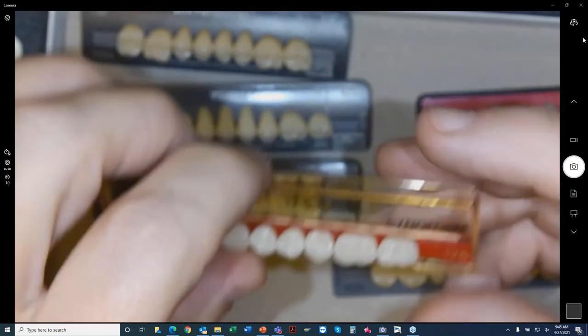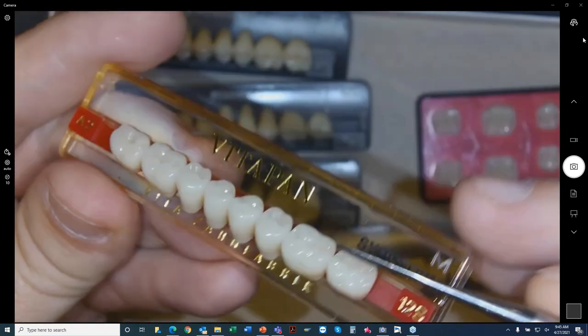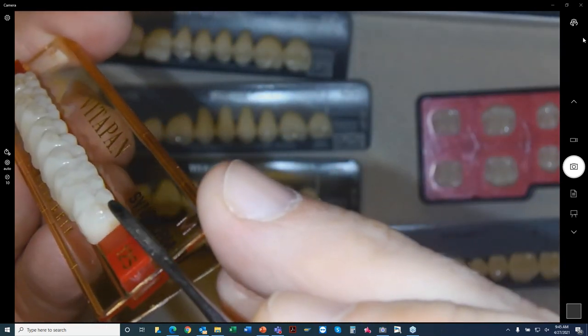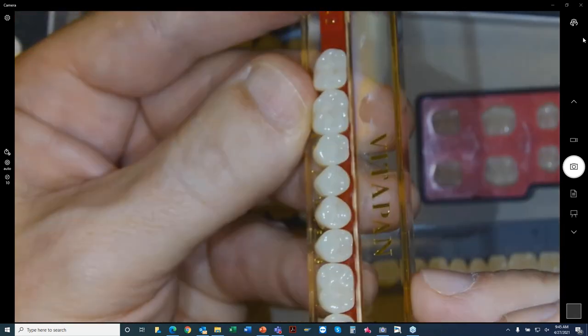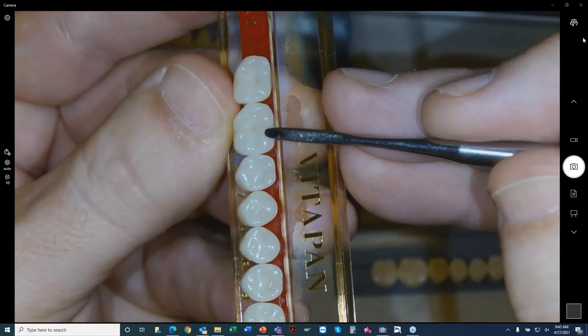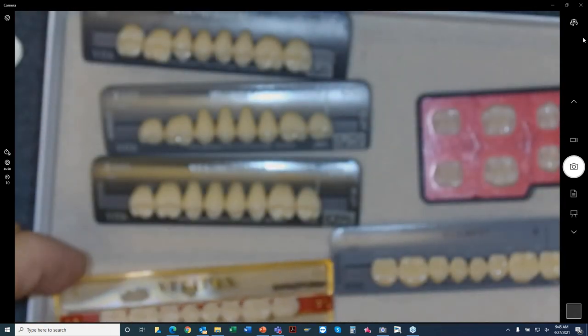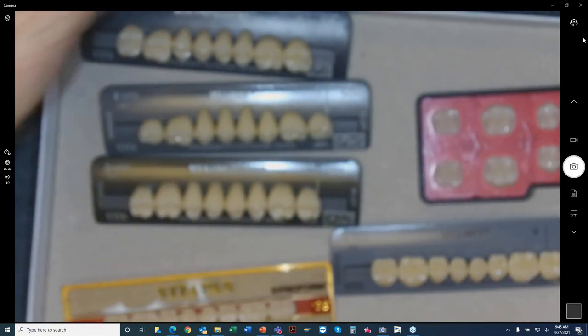And then you have, of course, the sinoform, which are very flat teeth. They only have a 5 degree in the central groove. All these cusps are very flat on the top here, okay? And then you just have the central groove. It's like a 5 degree tooth, if you will.